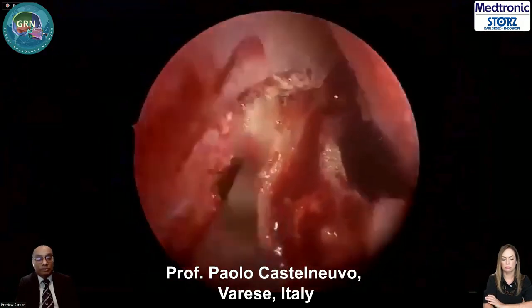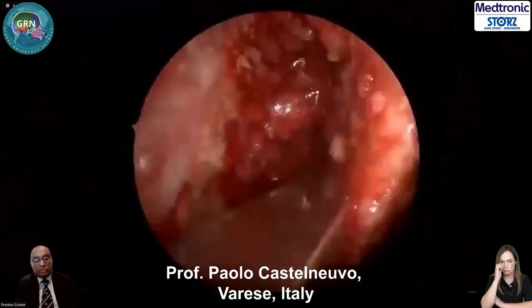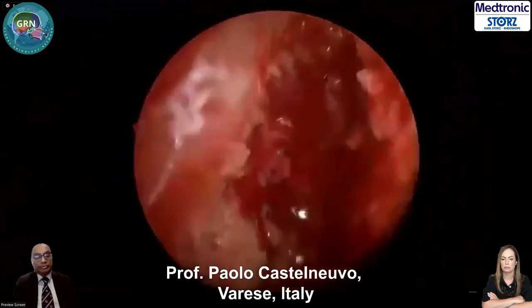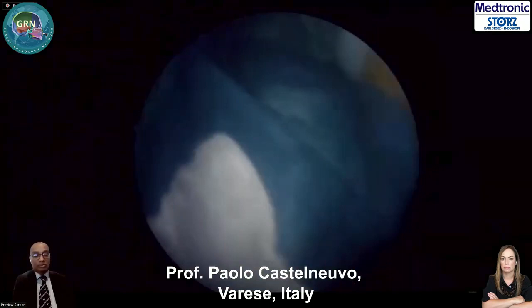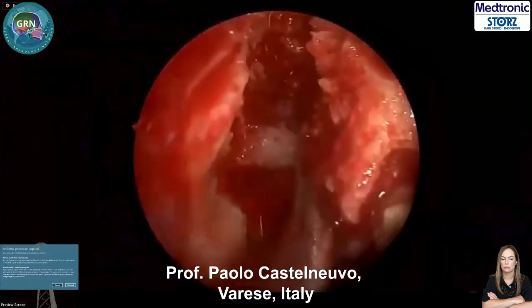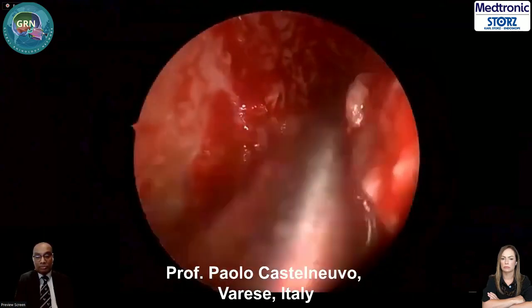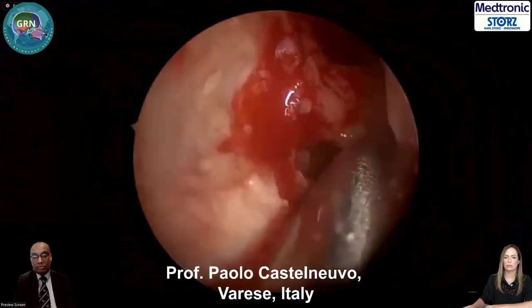Tap tap. The duct. This one was the origin of the inverted papilloma.